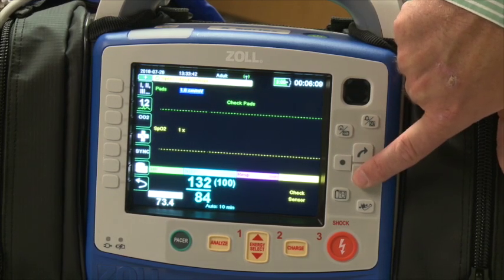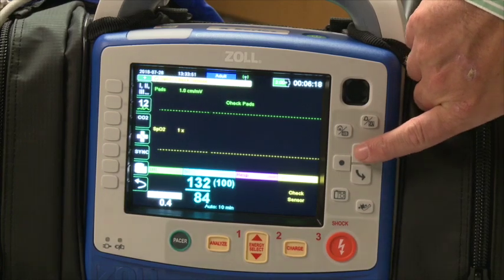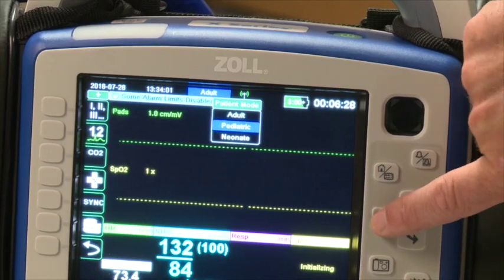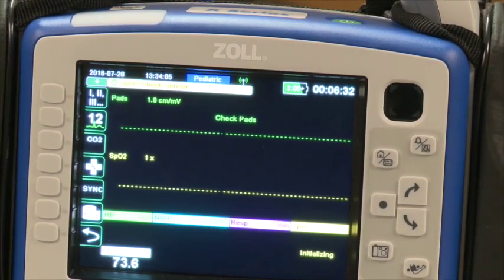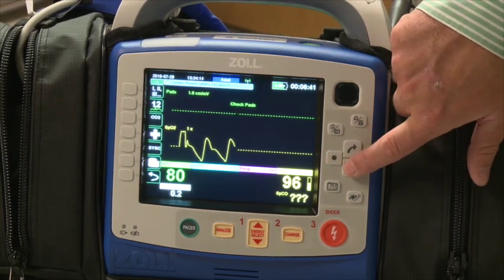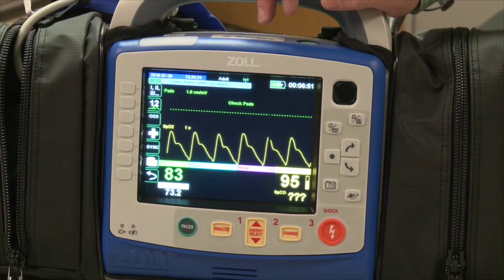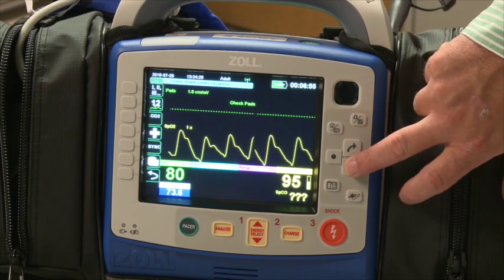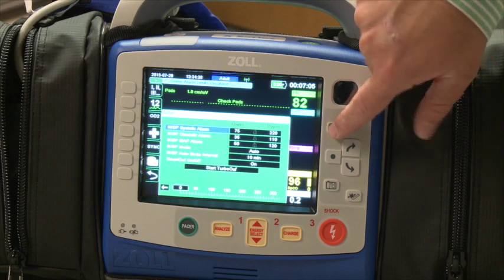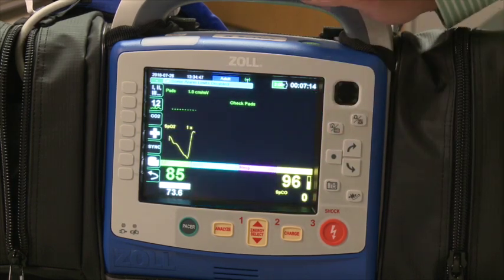Arrow keys move a blue box around the screen. Anything with a blue box has a sub-menu, meaning you can make a change. For example, if you highlight 'adult' across the top and you're going on a pediatric call, use the enter key to switch to pediatric or neonatal monitor mode — this changes the algorithms, inflations, and specific alarms. Anything changed with the blue box is a patient-by-patient change: if you put it in pediatric mode and turn the device off after delivery, the next power-on will return to adult mode. If you feel you've turned something on or off that you can't fix, simply power the device down and it will return to its configured state.